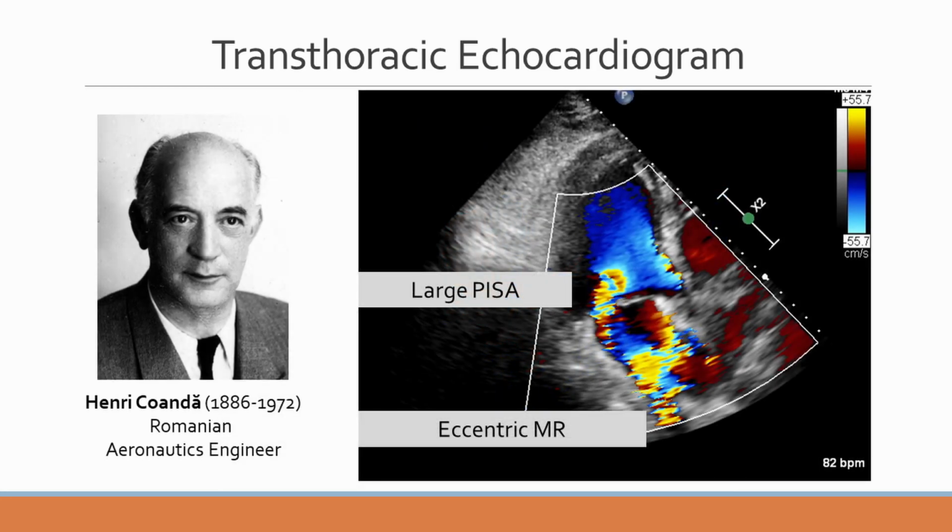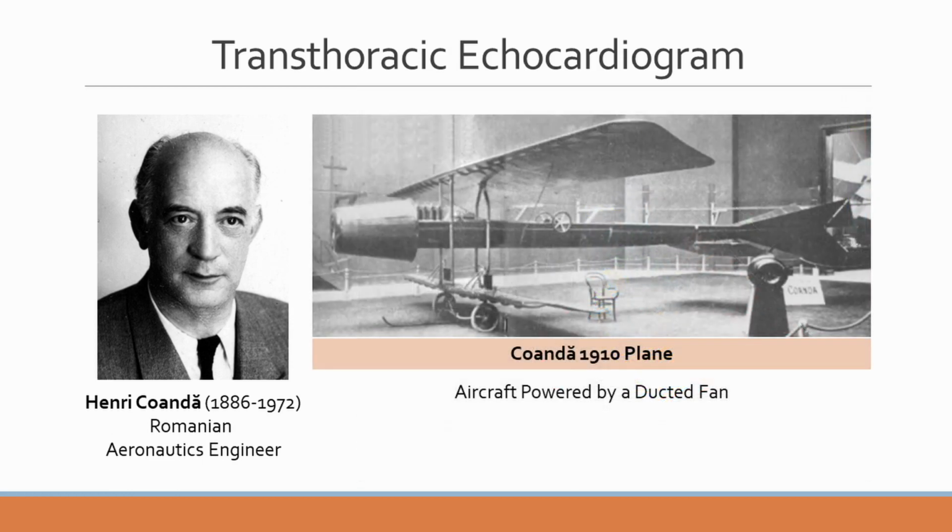So there's a large, eccentric, wall-hugging jet, known as a Coanda jet. If you ever wondered who Coanda was, he knew nothing about echocardiography. He was an aeronautics engineer. And this is his plane.